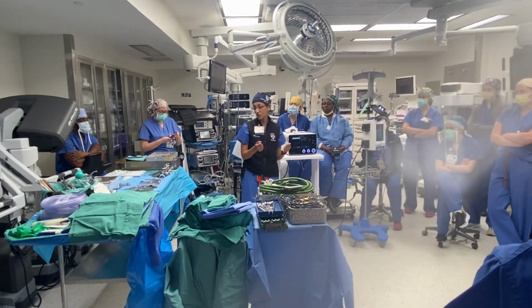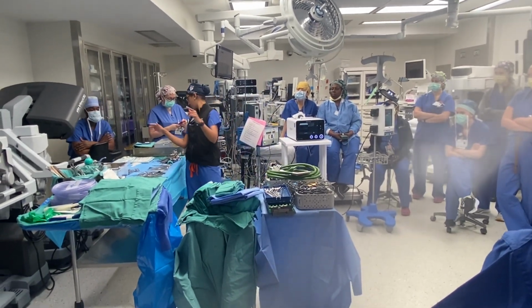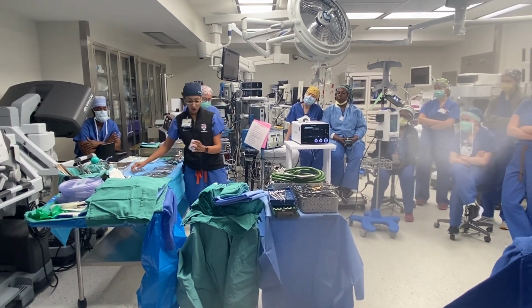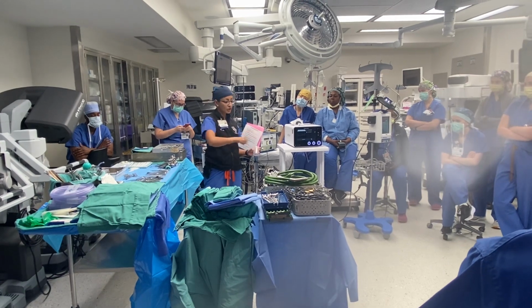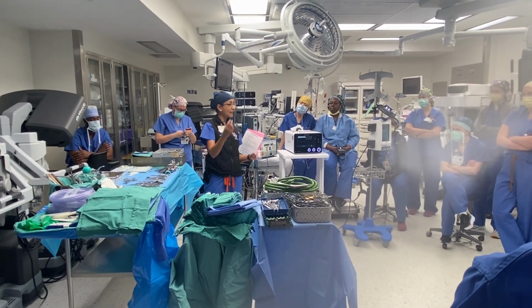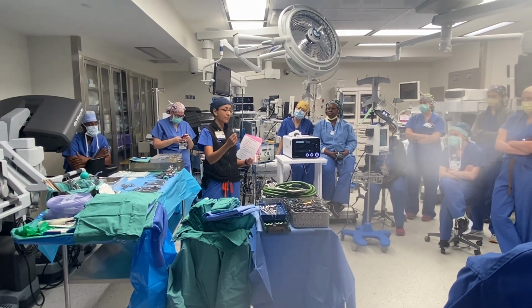Because it's so bloody, we utilize, you got Randy's here somewhere? Yeah, I think that's a cup right here. Okay, perfect. So we will sequentially insert our 1% lidocaine with epi. Epi will help decrease some of that bleeding.